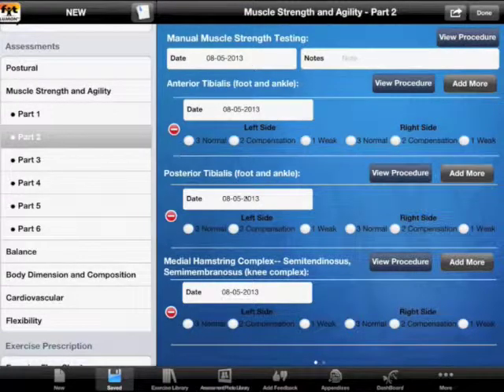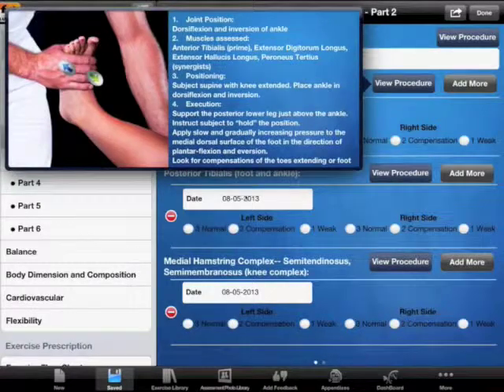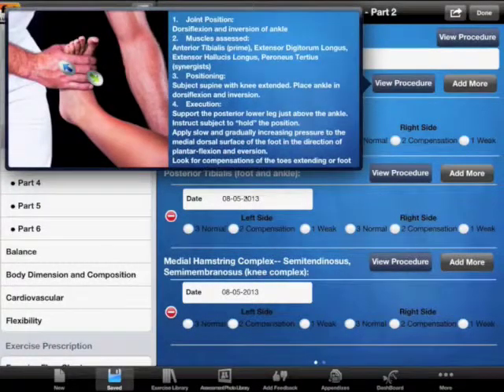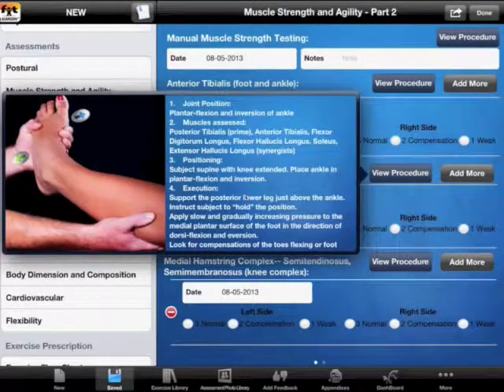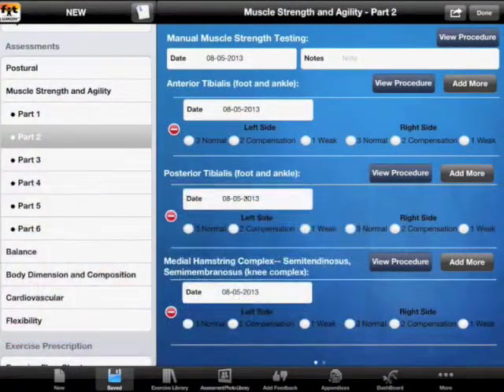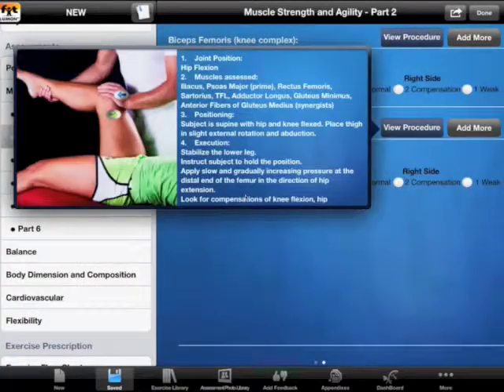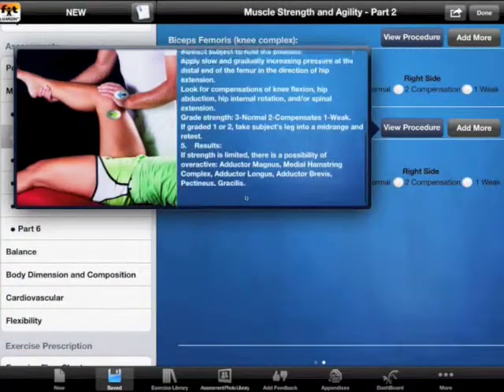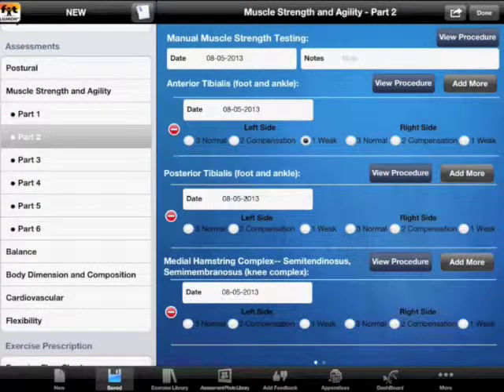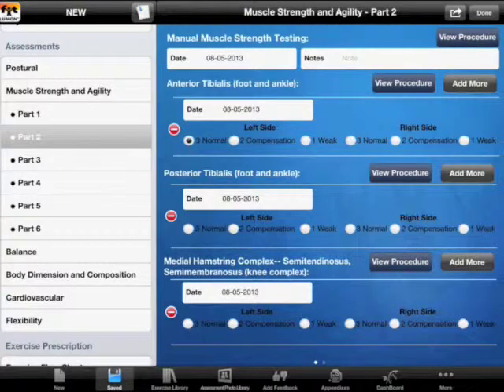Whenever we test a muscle, we can look at the procedure, scroll through the full description, and see a picture of how it's supposed to be performed. Every procedure is described and photographed. After testing the muscle, we can classify it as weak, having compensations, or normal. We can also test left side and right side separately.